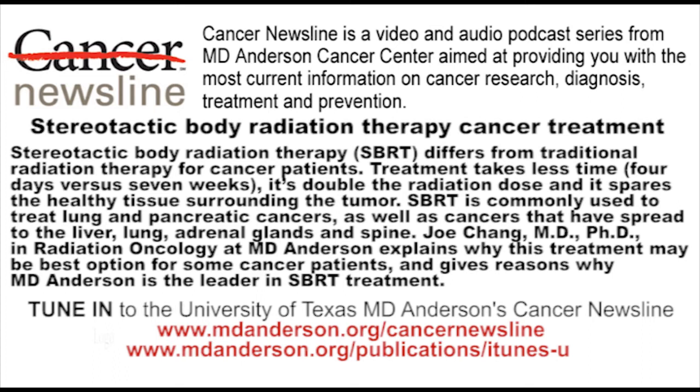Now, for people who are maybe not familiar or have not undergone radiation therapy, it's very important that they stay still and that they're always in the same position. So when you're talking about movement, we're talking about movement of organs and the tumor itself, correct? Right. So in typical radiation therapy, there's a frame that's built to hold them in the same position. But the CT on rails, as you described, negates the need for such a frame.